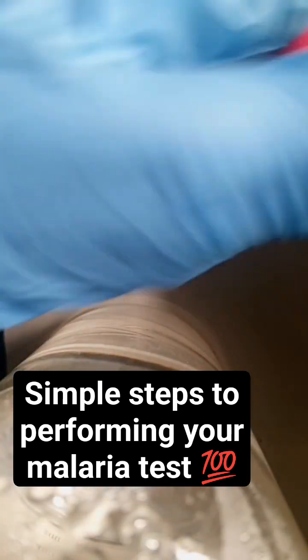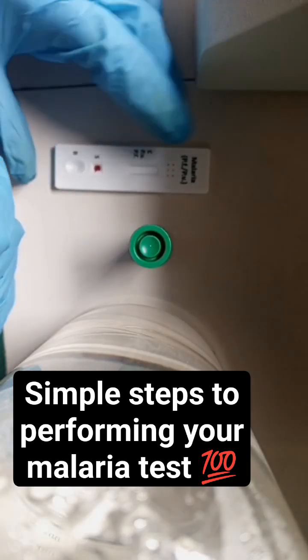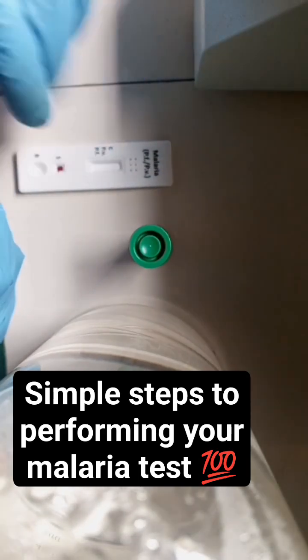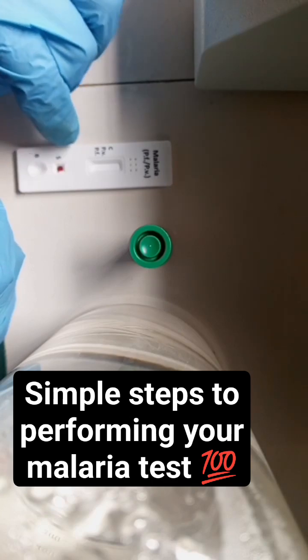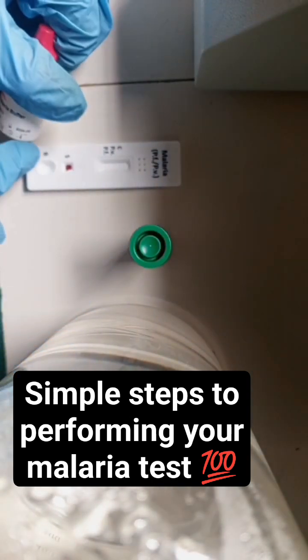Then you get your buffer. Watch where I insert the sample — at the sample spot. This is something a lot of people miss: they don't know where to insert it. You insert at the sample zone. Then for your buffer, you put it in the buffer zone.